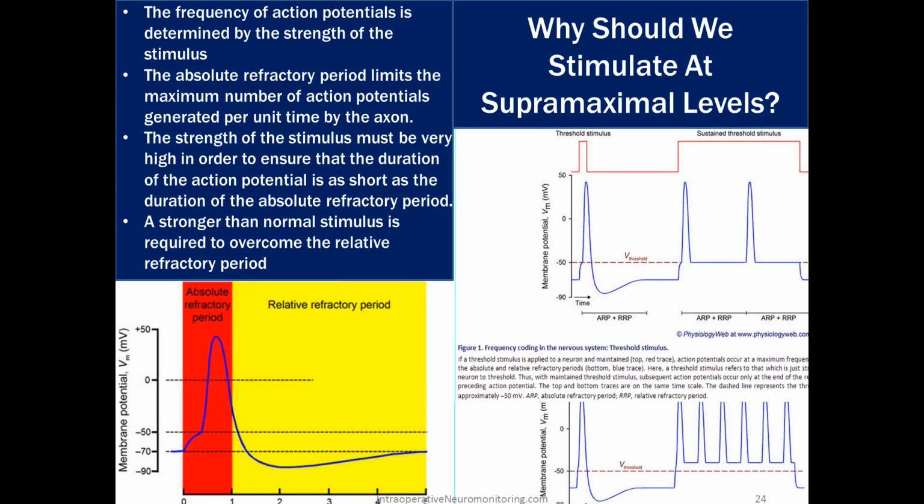We're trying to overcome this anesthetic effect by summating multiple groups of motor neurons, one after another. The ones that we don't stimulate with one train, we hope we're bringing it close enough to threshold, if it didn't fire, that the next one will hit it and cause it to cause an action potential. So we're making use of both temporal and spatial summation in order to elicit a response from the greatest amount of neurons in order to most likely achieve the most optimal motor response we possibly could. So that's where this all comes into use.